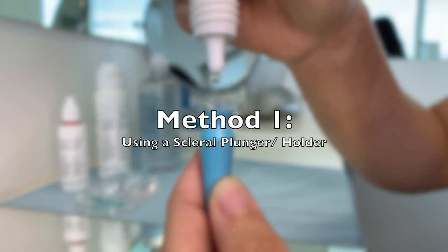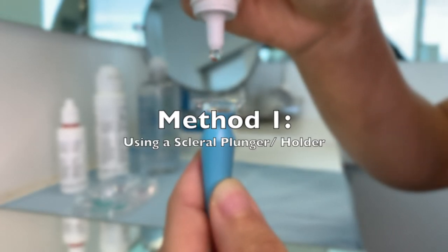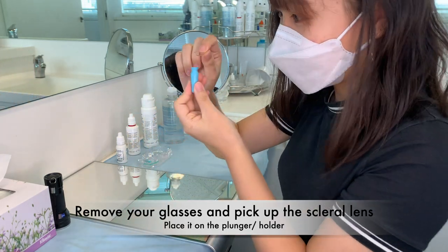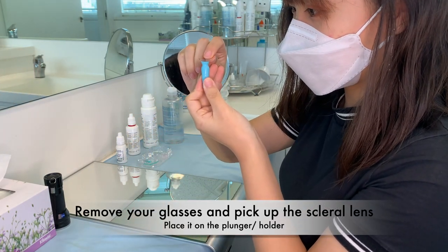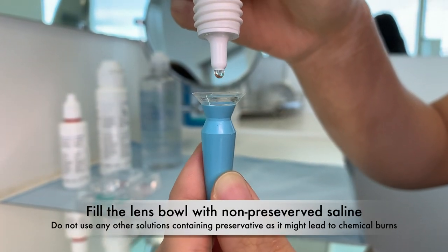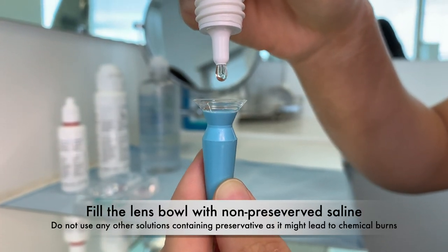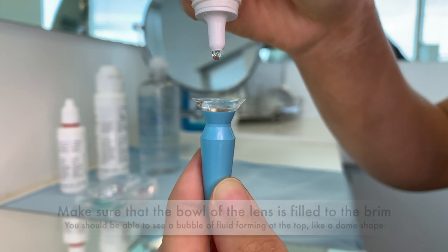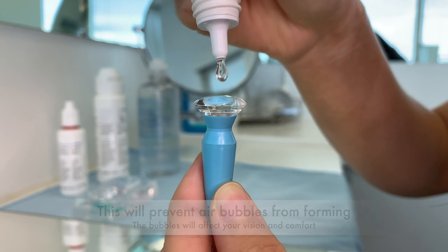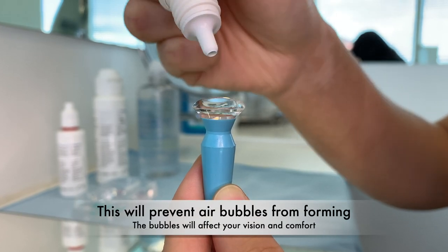There are several ways to insert scleral lenses. Here is the first method. Remove your glasses and place the scleral lens on the plunger, with the concave side facing up. Fill the lens bowl with non-preserved saline — using any solutions containing preservatives may lead to chemical burns. Make sure the bowl of the lens is filled to the brim; you should be able to see a dome shape. This will prevent air bubbles from forming.